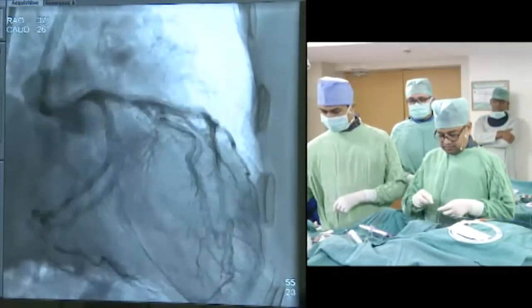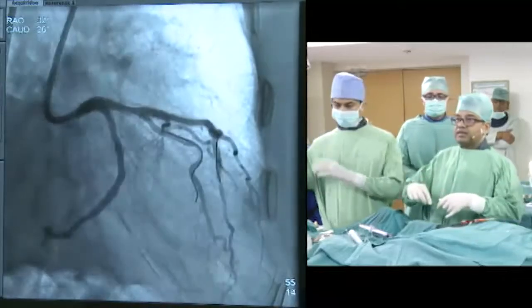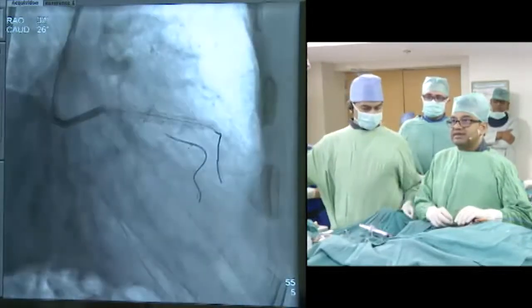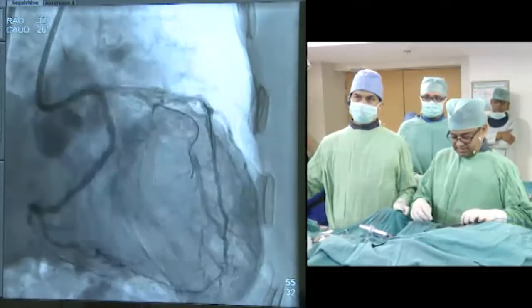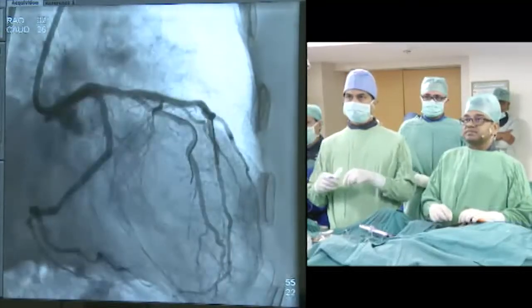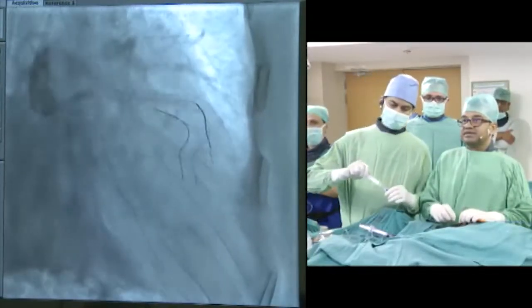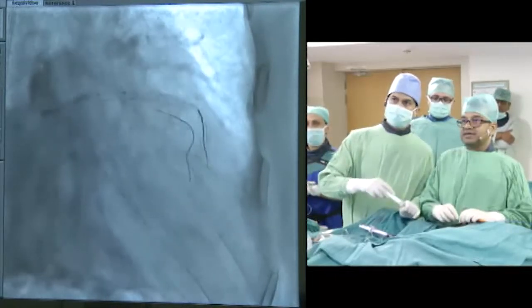We were just talking, Dr. Buzman and I, that you see the outline of probably a deep wall dissection, which was created from the pre-dilatation, which is okay. And as long as you have expansion and apposition on OCT, you're okay. I think the big thing with BRS we learned in the United States, unlike DES where you get away with malapposition, in BRS malapposition is potentially fraught with major problems.